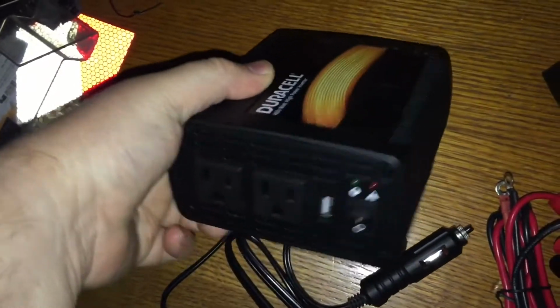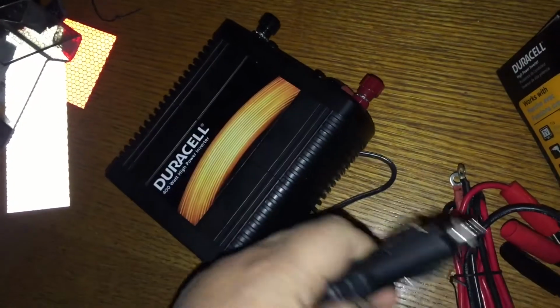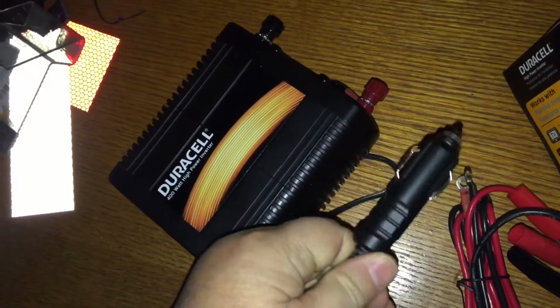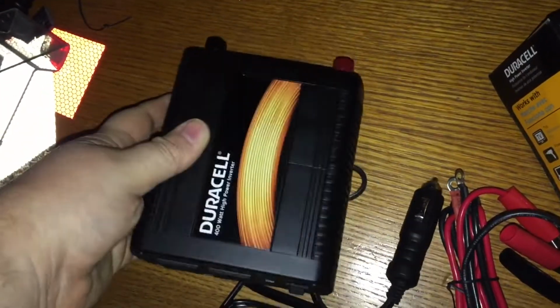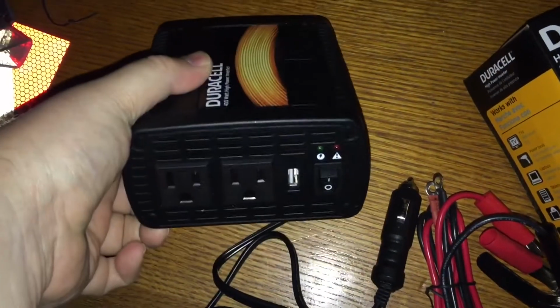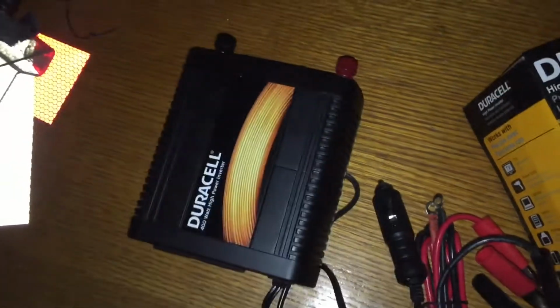Anyway, you just plug that in. If your RV or camper is equipped with 12-volt receptacles like cigarette adapters, you just plug that in and it'll start working. Your CPAP will start working, and hopefully you have enough power to run the night. But if you're plugged in, if you have solar, if you have multiple batteries, you should be able to do it okay.